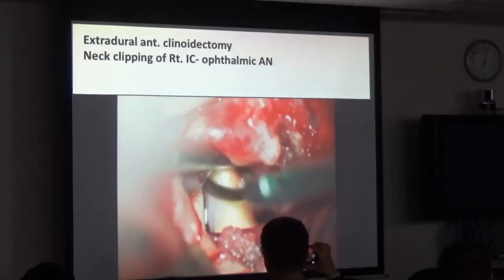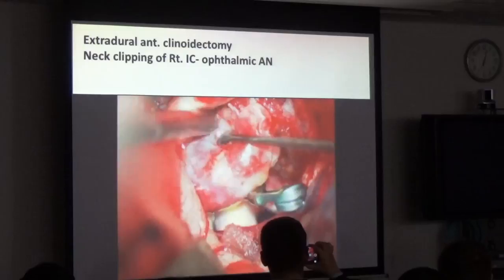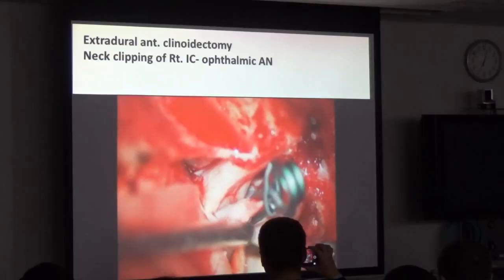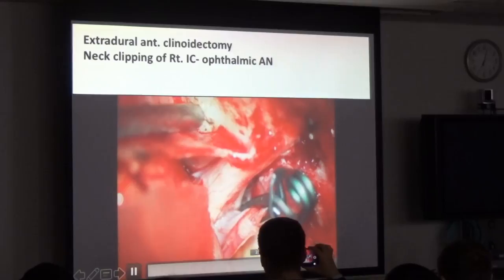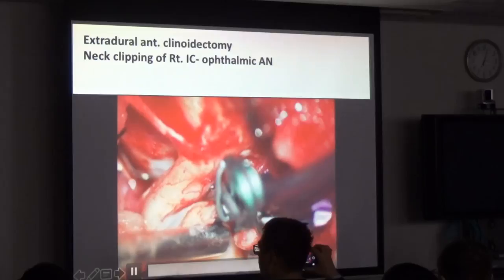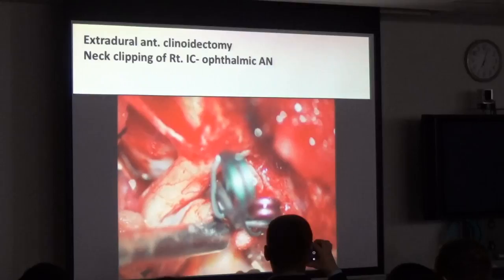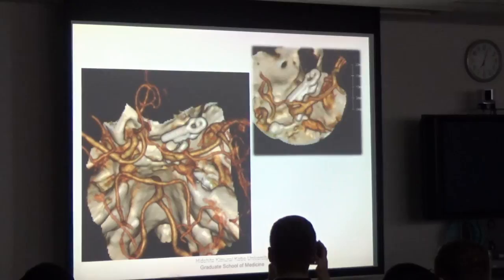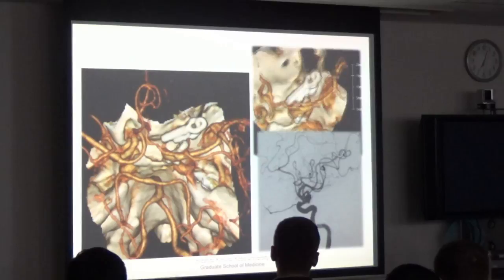As well here. And the distal clip was applied. And the suction decompression started. As shown in the morning, the aneurysm decompressed sufficiently and the clip was applied. This technique is not so difficult, once you understand the anatomical structure and technical pitfalls, it's not a difficult procedure. The patient has no new infarction, new hemorrhage, and the aneurysm disappeared. And the visual disturbance improved post-operatively. Maybe 3 months later, she recovered so well.